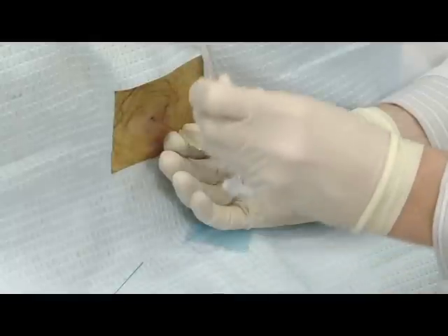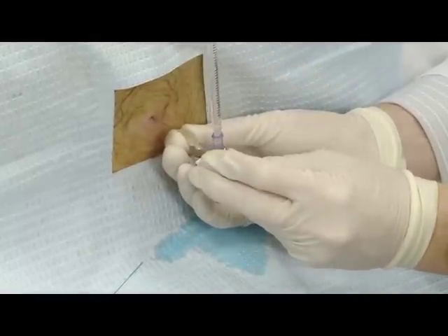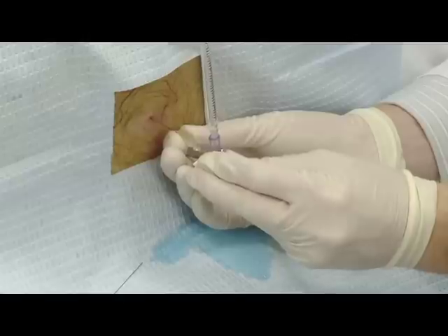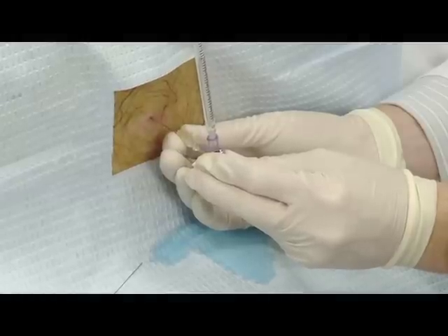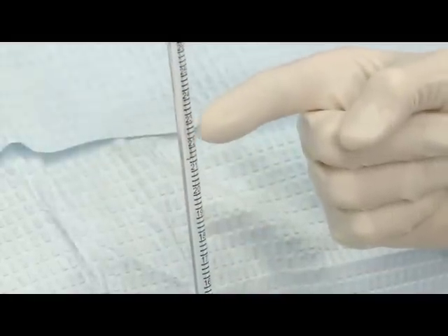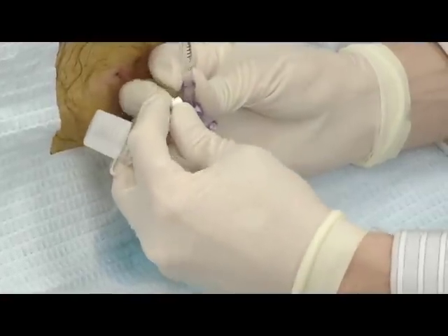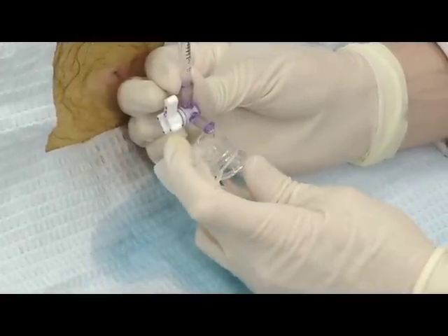Once you have CSF, remove the stylet and attach the manometer to obtain an opening pressure. Open the stopcock valve toward the manometer. To obtain an accurate measurement, instruct the patient to carefully extend their legs fully and relax. Once the column of fluid stops rising and the measurement is noted, rotate the stopcock valve to allow the CSF in the manometer to drip into the first collection tube.